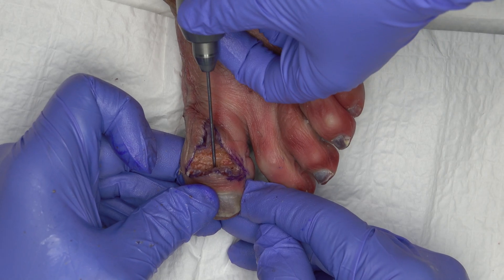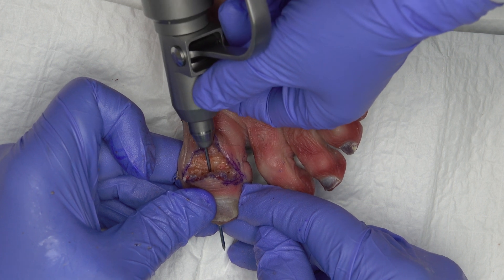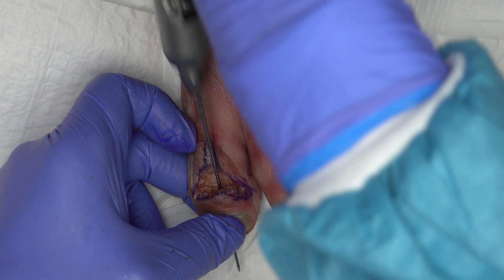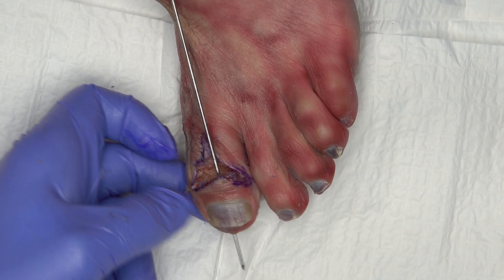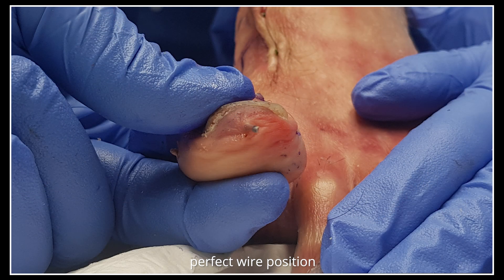A double-pointed 1.6 mm K wire is inserted retrograde into the center of the distal phalanx until it exits through the dome of the big toe, just below the toenail. The 1.6 mm K wire is then re-clamped in the drill, which guides the 1.6 mm K wire from distal.